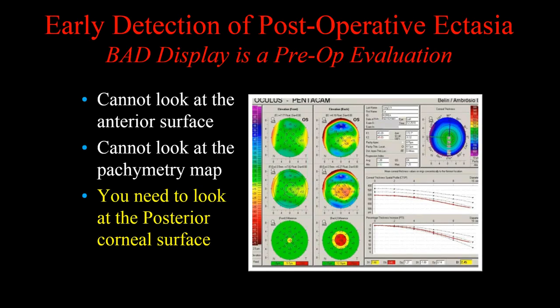A lot of times, people will send me the Belin/Ambrósio display, and ask me, is it okay for an enhancement? The Belin/Ambrósio display was designed for preoperative evaluation. It looks at the preoperative map against a large database of normal eyes. It really isn't designed, it's not meant for a postoperative evaluation.